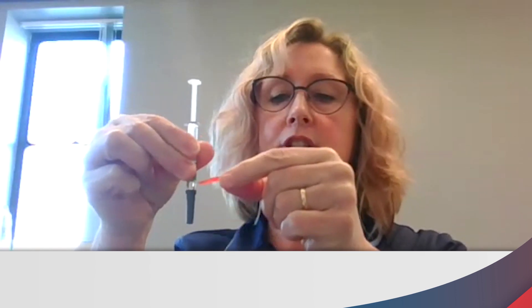When doing your syringe, take it out of your packet and hold it firmly like a pen. Move the orange needle snapper out of the way, then pull the needle cap off — it can be a bit tough. Hold it with the needle pointing down so the air bubble comes to the top of the plunger. Choose which area of skin you're going to use, then pinch the skin like you're pinching an inch. Put the needle in at a 90 degree angle, put it to the skin and push it in.